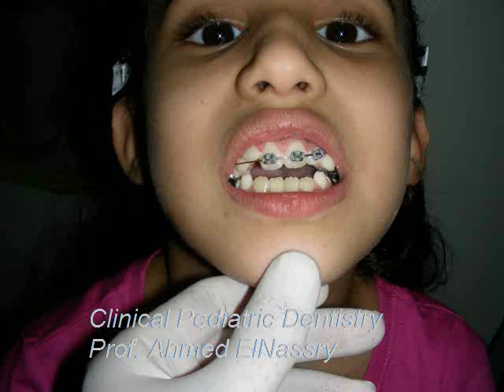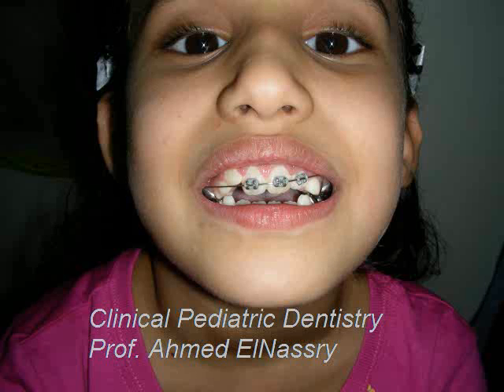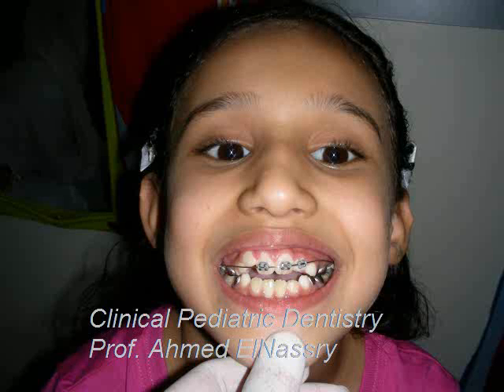The amazing point here is that if we succeed in preventing the protrusion of the tongue between the upper and lower front teeth, self-correction will occur. After about four months it is clear and obvious that the anterior open bite is closing. We then removed the habit-breaking appliance and started interceptive orthodontic measures using a four-by-two fixed appliance for complete closure and final alignment of the teeth.